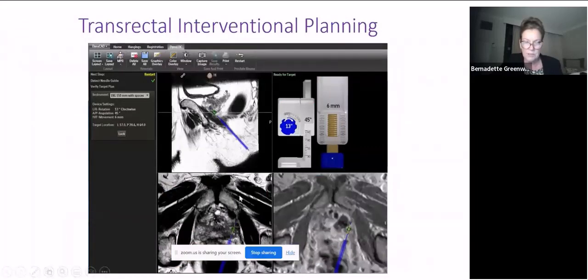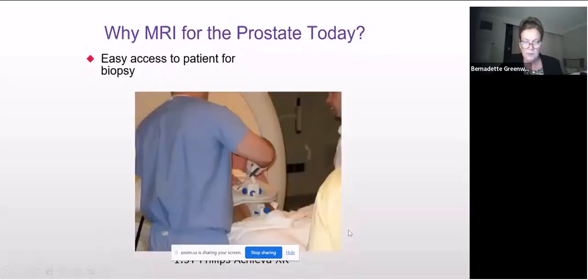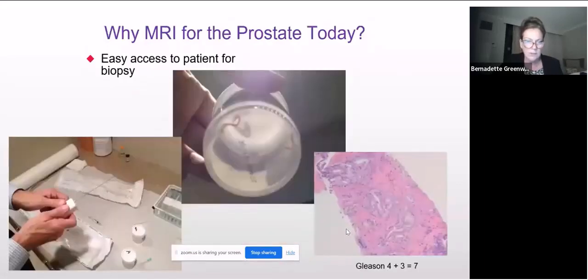When you insert the needle guide, you can see the trajectory of what you're aiming for. The computer tells us how far to angle in each direction to achieve that target. We adjust to that location, pop in the needle, and ta-da, we get the specimen. This is what it looks like in the hands of the physician. And then when the needle comes out, the little tiny chamber at the tip is holding a piece of flesh. And that little thing is about the caliber of angel hair pasta, and it's just under 2 centimeters long.